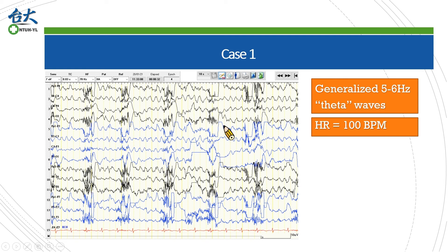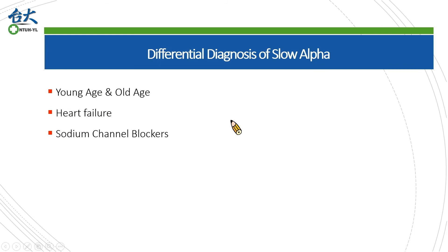Finally, we reach the background of this EEG. We may see the patient has tachycardia at around 100 beats per minute. There is generalized rhythmic theta-range activity. I use the term theta wave to describe its frequency range. However, considering the physiology of such generalized rhythmic activity, it may be a very slow variant of background alpha activity. Differential diagnoses of slow alpha rhythm include: the background may be only 6 Hz in a normal child, becoming faster in adults but slowing again in older people. In patients with heart failure, background alpha may also slow down due to decreased brain perfusion. In addition, people taking sodium channel blockers — such as carbamazepine or phenytoin — have been reported to have slower alpha activities.